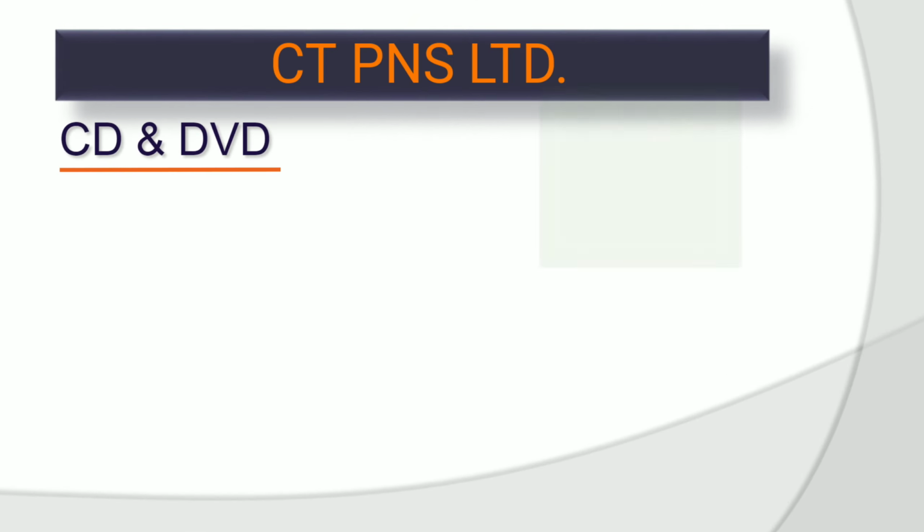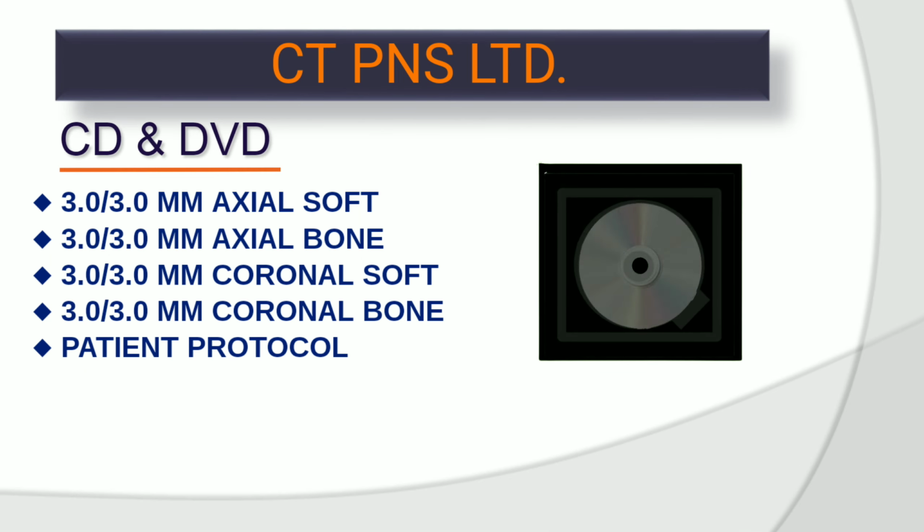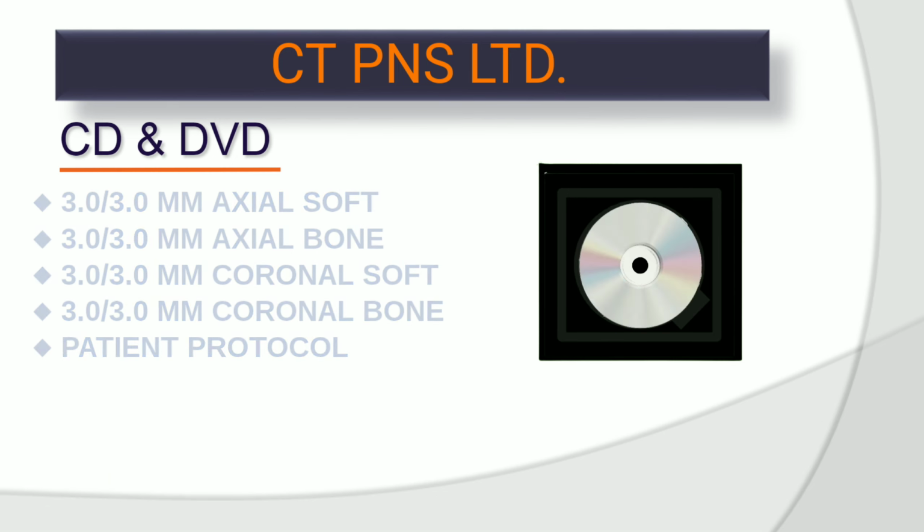Data for CD and DVD. You can give thick data in CD like 3 by 3 mm axial soft, 3 by 3 mm axial bone, 3 by 3 mm coronal soft, 3 by 3 mm coronal bone, and patient protocol.